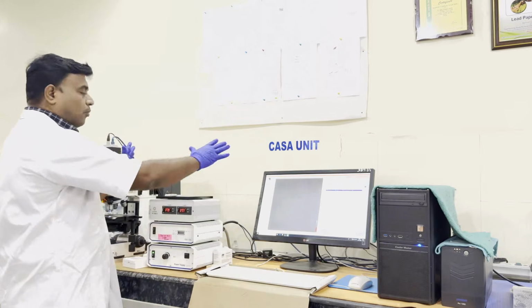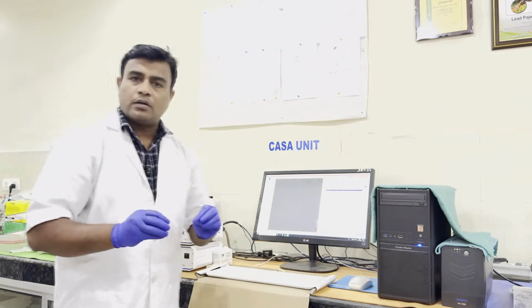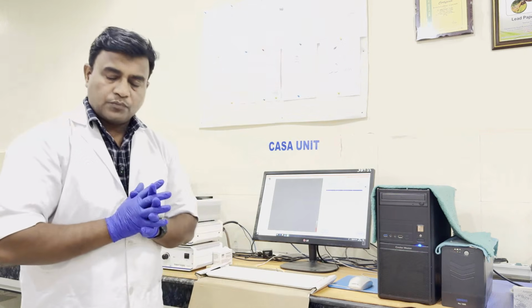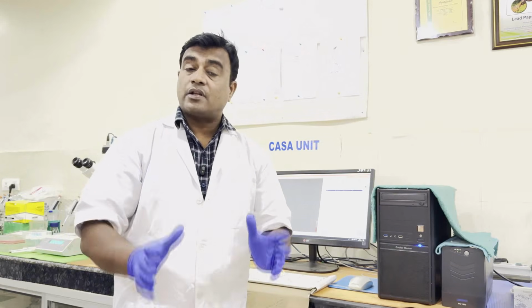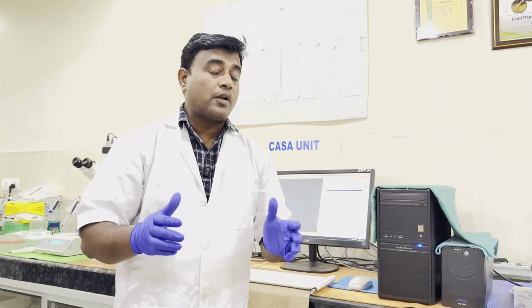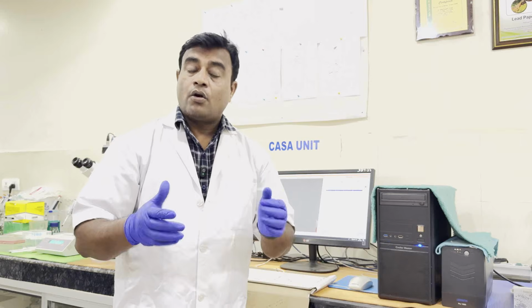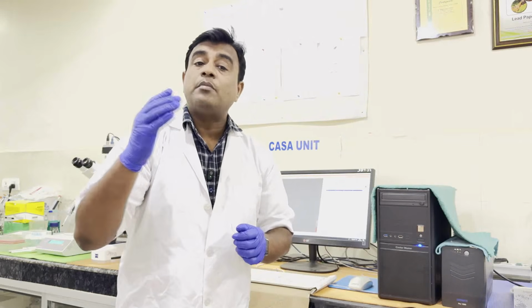So these are common hardware components which are usually found in all types of CASA systems. I prefer an open system because our lab specializes in signaling studies where we use multiple drugs, and in a day we take 150 to 200 readings at different time intervals.